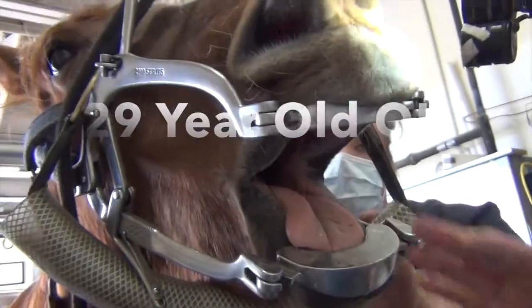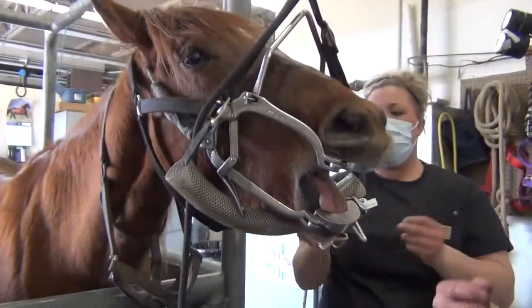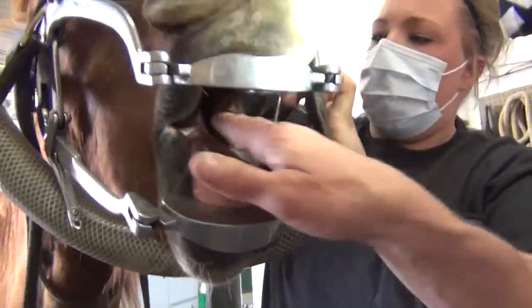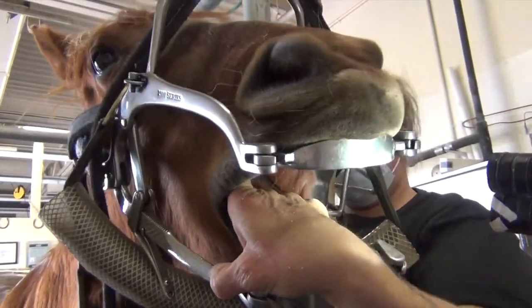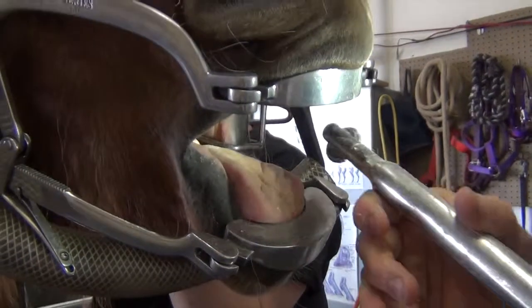For the lower cheek teeth, we actually do the grinding on the inside upper edge of the lower cheek teeth. It's on the lower teeth. The sharp rims are on the tongue side, as you can see in the left lower row of cheek teeth that we have right here. And so I'm just going to go ahead and start grinding that.